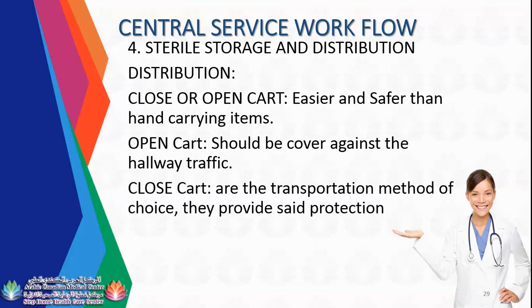So closed or open cart, which is easier and safer than hand carrying items? An open cart should be covered against the hallway traffic. Open carts, guys, are prone to contamination because your instruments are exposed, while the closed cart is the preferred method of sending instruments or getting the soiled instruments from CSSD to the point of use, or from the point of use to CSSD.